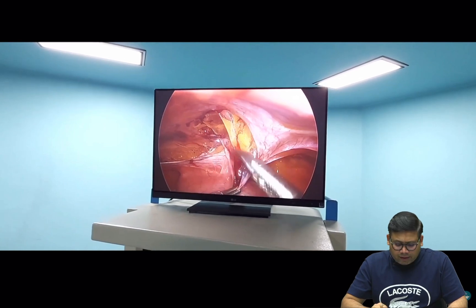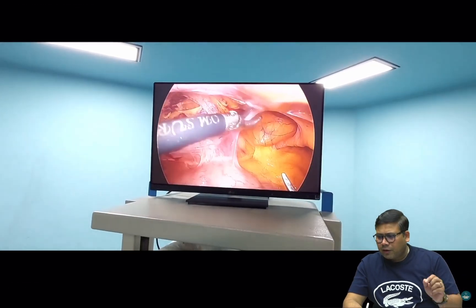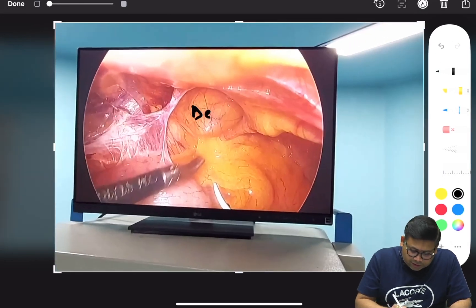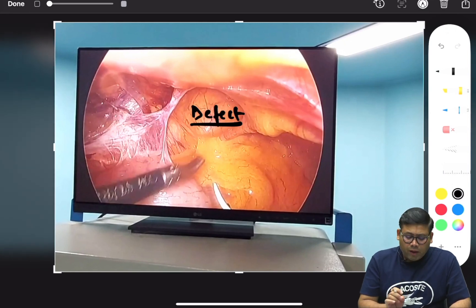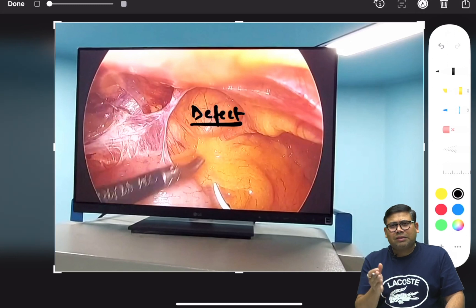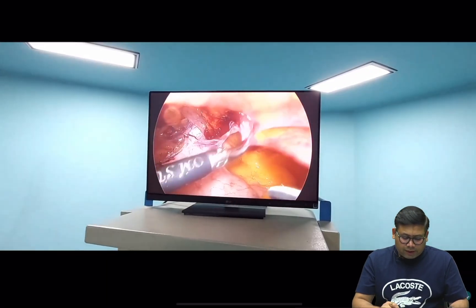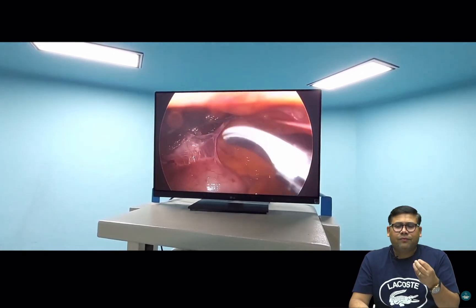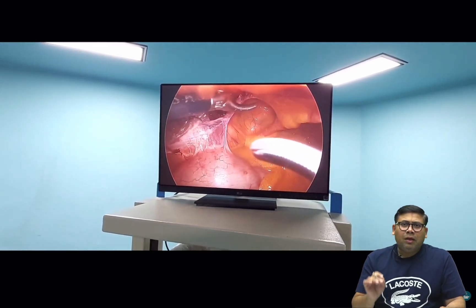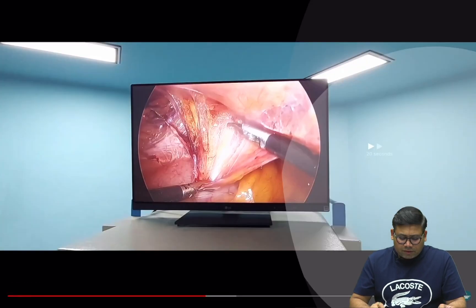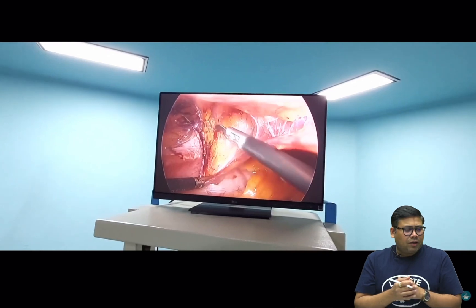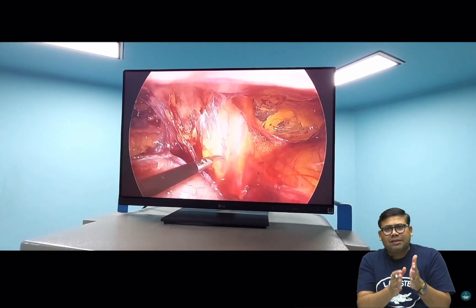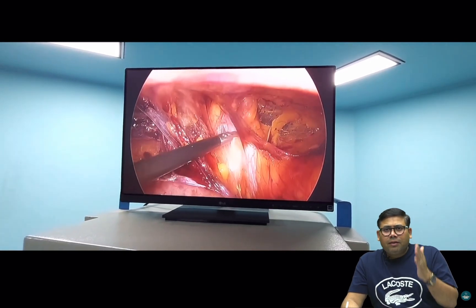Gently sweeping everything toward the abdominal wall — not pulling toward me — the dissection is complete. I can show you the defect: it is medial to the deep ring, confirming a direct inguinal hernia with a big direct defect. To identify the bladder: fat in the pelvis belongs to the bladder. I am going up to the lateral border of the bladder through flimsy areolar tissue.